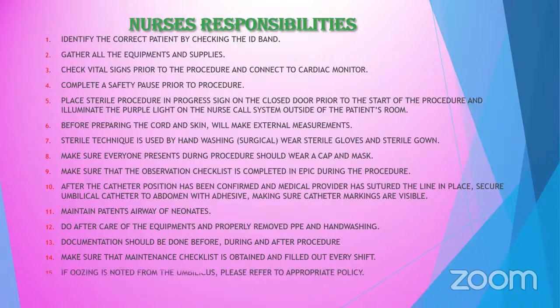I will show you all the documentation later. The best way to document, Madonna, is to have another person observing and documenting, nurse number 2 or number 3, just observing. Actually, the maximum number of people present in the insertion of UVC and UAC is one doctor or consultant on standby, who can try if it fails, and then 2 or 3 nurses: one scrub, one circulating, and the other to help.